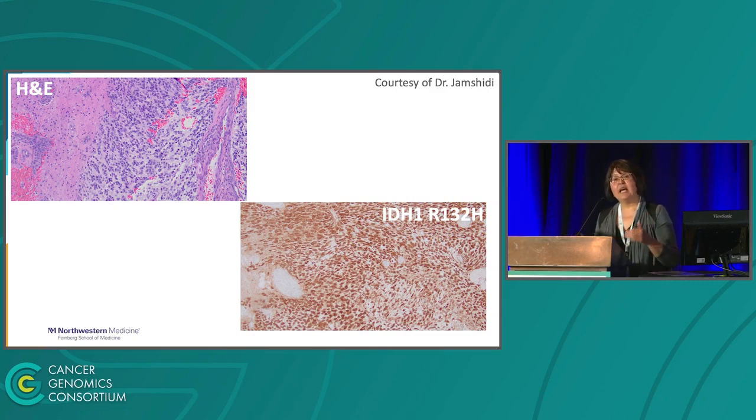Means what? Now for careful subclassification of classes, we need to differentiate between what? Oligodendroglioma, 1p19q codeleted IDH mutant, and astrocytoma IDH mutant, right? So that's what pathologists are now most interested in. And look at the result of methylation array classification. It nicely confirmed that, yes, this tumor is IDH glioma. But for subclass, it placed it right in between.